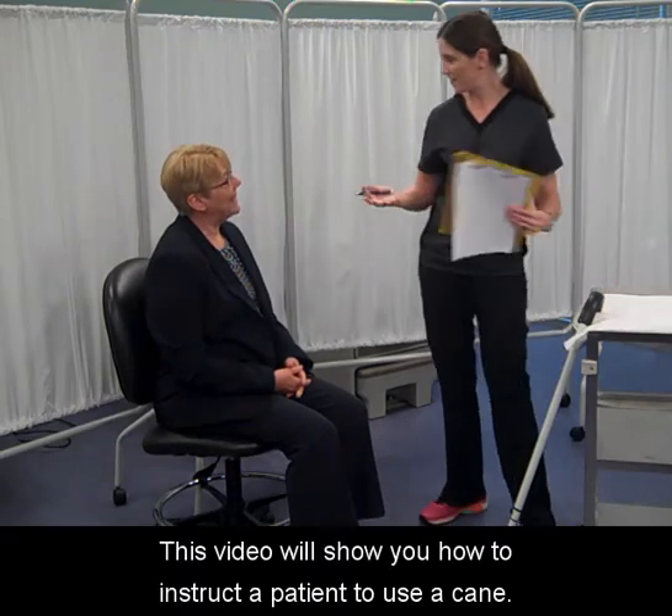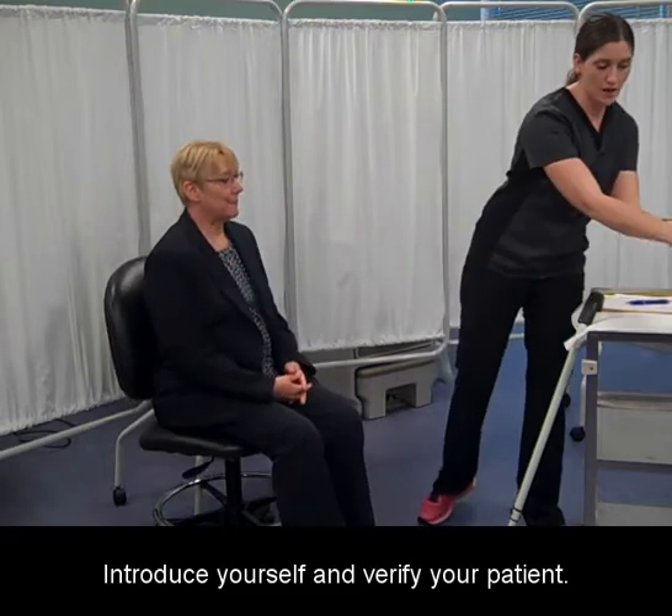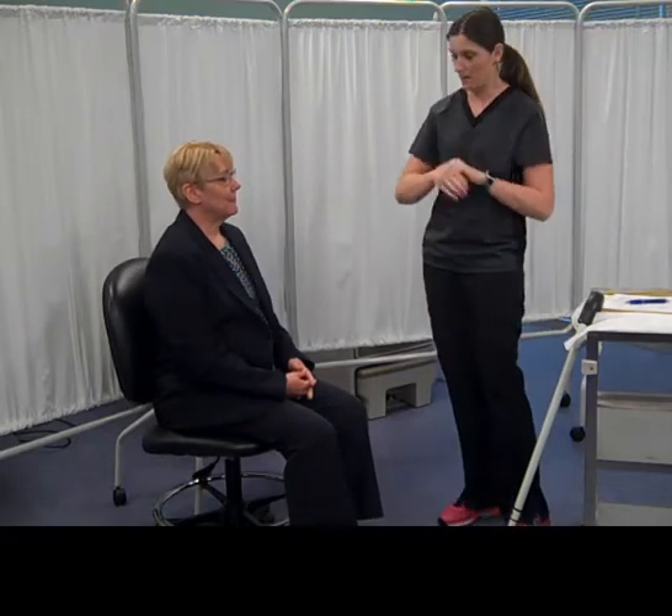This video will show you how to instruct a patient to use a cane. Introduce yourself and verify your patient. Wash your hands.